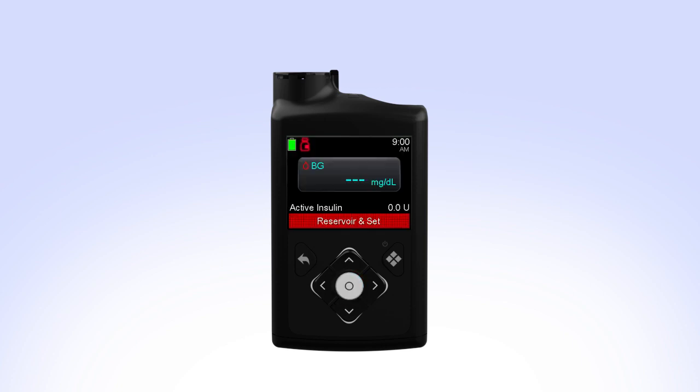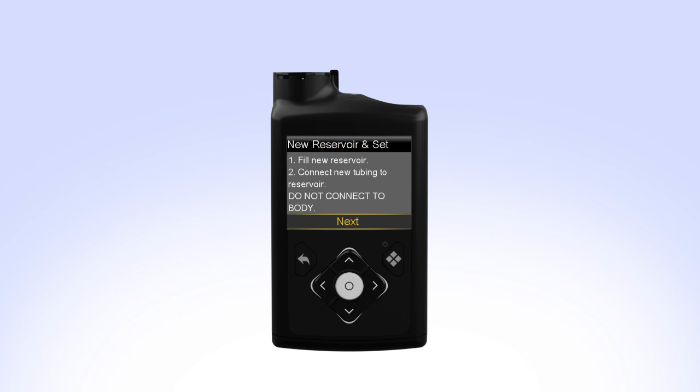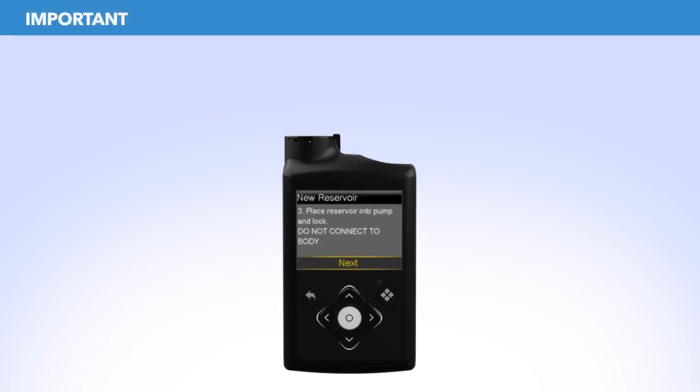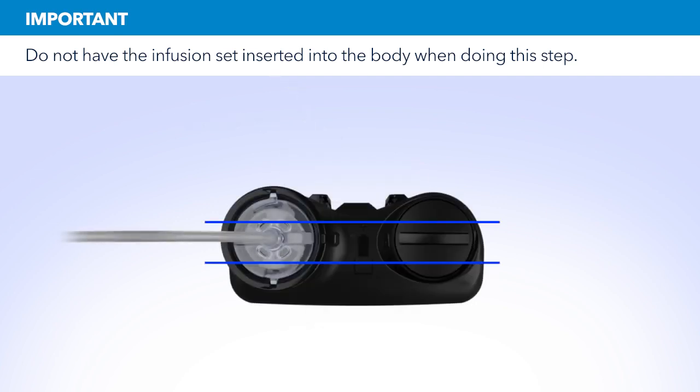While you are filling your reservoir, the backlight may have turned off. Press the Select button to turn the screen on again. Press Select to go to the menu screen and then select Reservoir and Set. Since you have already filled the reservoir and connected the tubing, select Next. Put the reservoir in the pump and turn the tubing connector clockwise until you feel the reservoir lock into place. The tubing connector should line up with the groove in the battery cap of your pump.